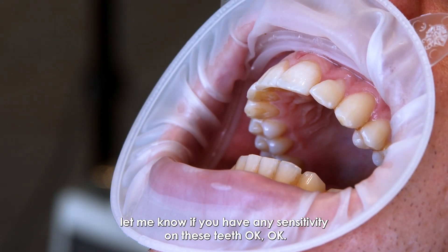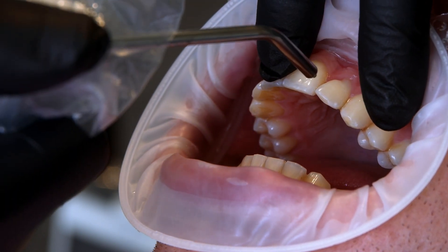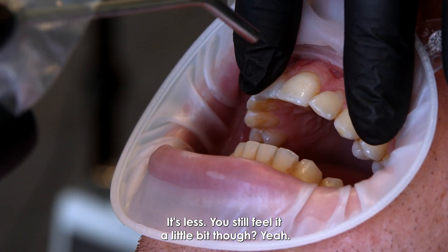Let me know if you have any sensitivity on these teeth. The patient reports it's less, though still noticeable a little bit.